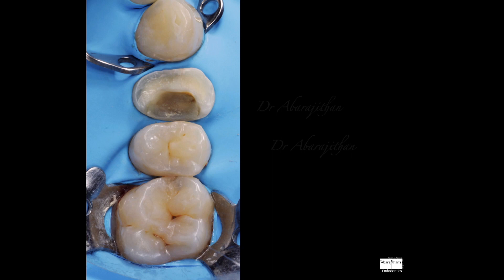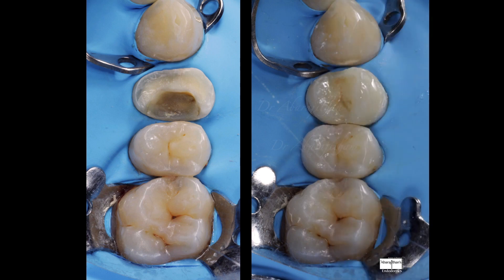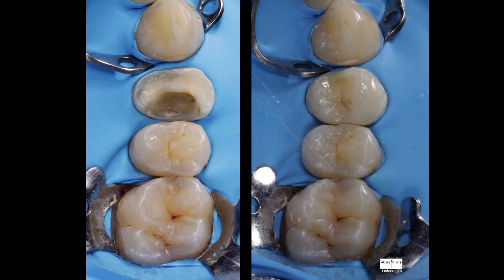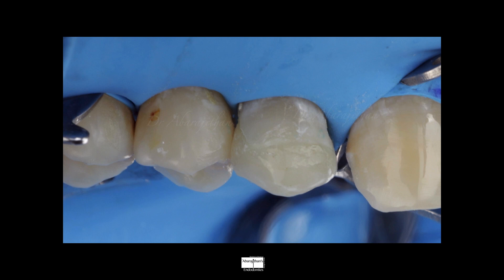Once the final restoration has arrived, on the day of bonding, you can see the gingival health is much better and the gingival margins are held exactly where they were, with the help of the temporary. I am now able to isolate easily, which is an important factor for these bonded adhesive restorations, and then I'm able to bond it with good isolation — you can see the nice adaptation of the bonding.